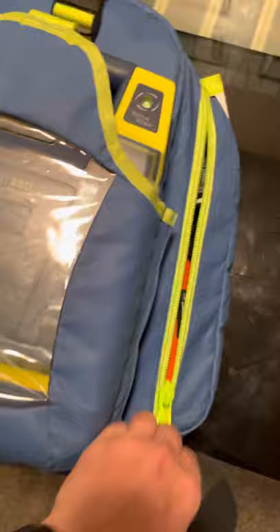On this side, I carry all of my vitals: an adult and child blood pressure cuff, glucometer, stethoscope, pulse ox, oral thermometer, and probe covers.